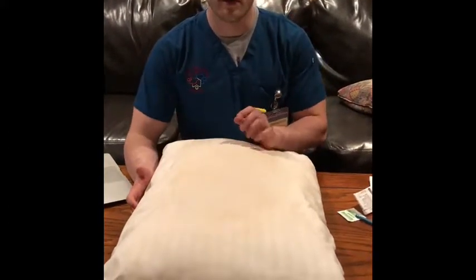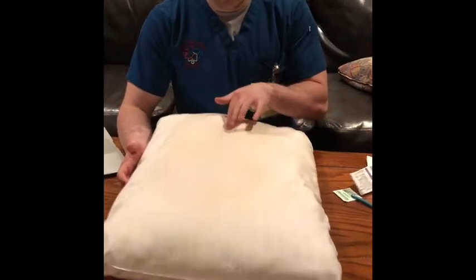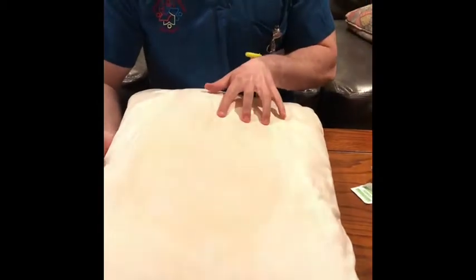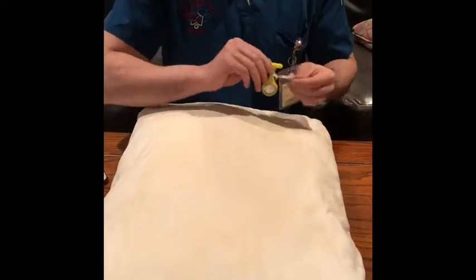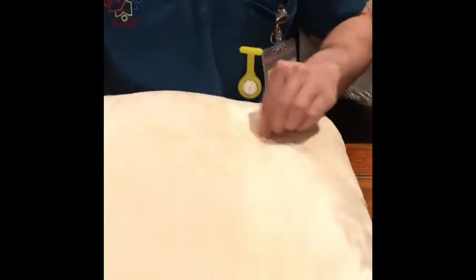So when landmarking for an abdominal injection for subcutaneous, it will be 2 inches from the umbilicus. So if we say the center of this pillow here is the umbilicus, so about 2 inches from there. And then before administration, you would use an alcohol swab and just clean that inside out.